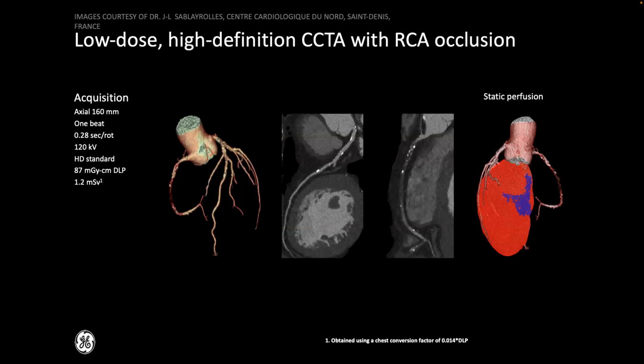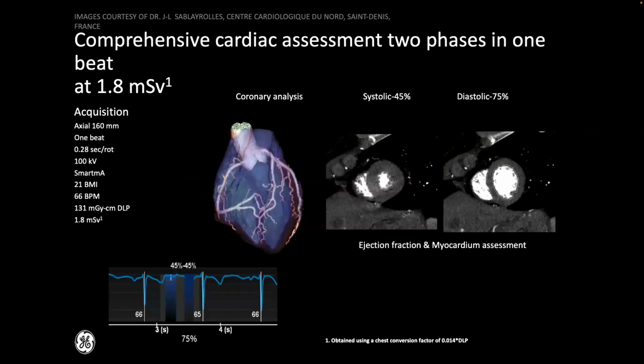If the person's a little person, then you can get away with really low dose and lower energy x-rays, because the 80 kV x-rays go through the person, right? 80 kV x-rays just don't go through a large person. They're too big. So if you have the right morphology of the patient, you can get away with something like this, where you get the whole scan done in about a millisievert, right?